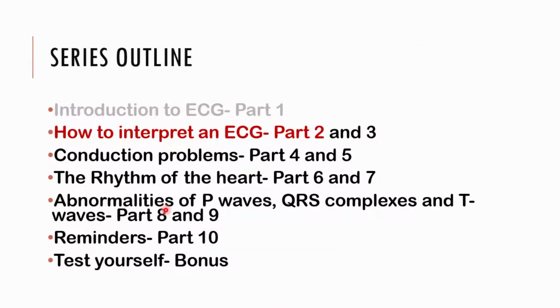So in our previous lecture, we introduced the different parts of the ECG. I hope everyone understood that lecture very well, because this will now lay the foundation for the next lecture and of course the subsequent lecture.